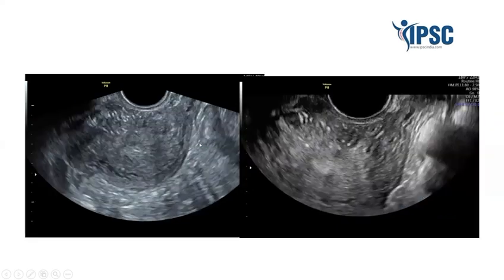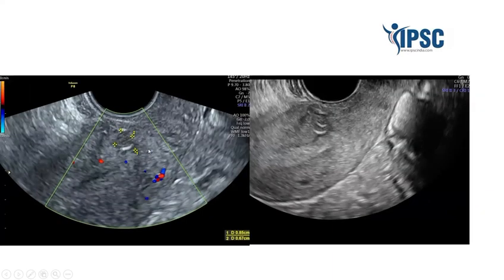cavity. On transverse imaging of the uterus, few echogenic foci were seen along the myometrium, which were consistent with the sutures. On further magnification, the hypoechoic cavity also contained those echogenic areas suggestive of the suture extending into that cavity. A detailed magnified image showed that the cavity is continuing with the endometrial cavity, and here you can see the communication, and the depth of this cavity was almost 8.5.